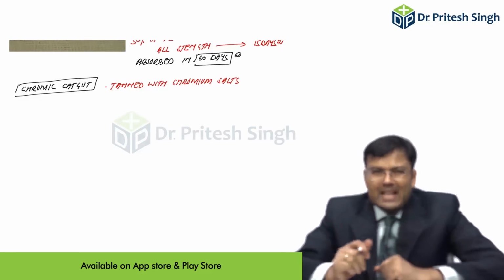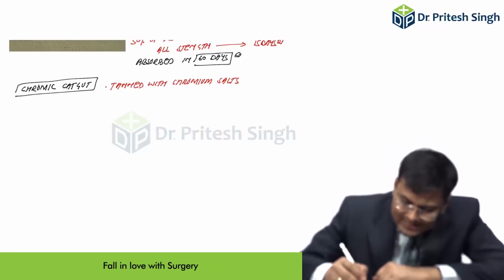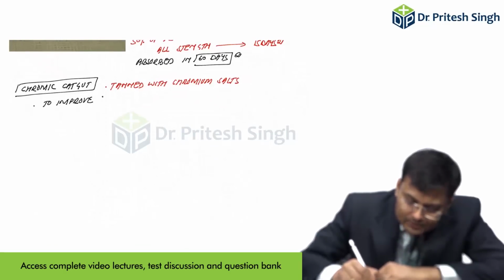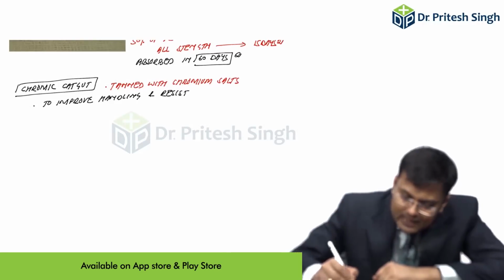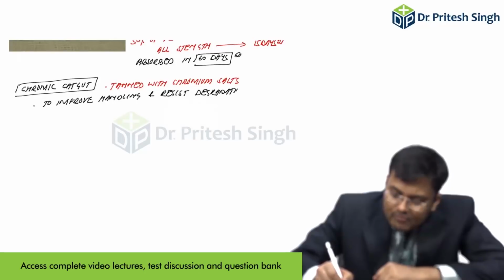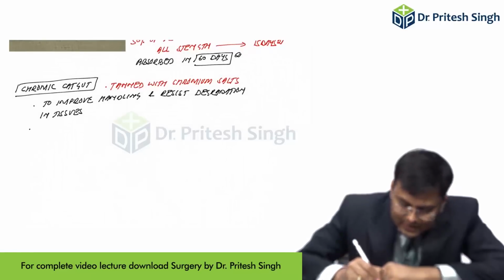Just to improve the handling of the suture and resist degradation in tissues.